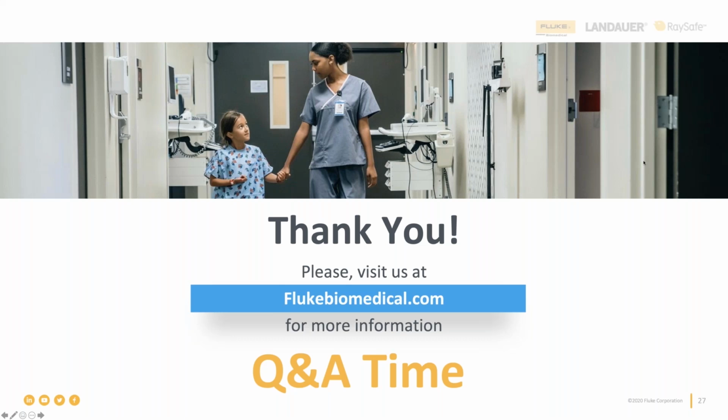And Katia talked about it earlier in the webinar in terms of alarms. So you want to make sure that the patient monitor is able to pick up on someone that is hyper and hypotensive. You want to make sure that it's detecting heart rhythms as it should and communicating that to the physician or nurse.